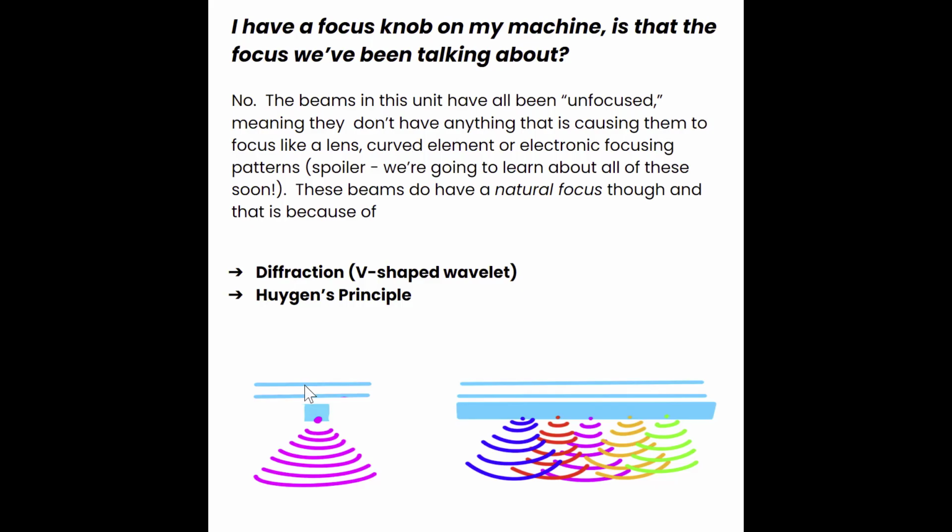So we have this example here. We can see the pressure changes are happening on the PZT crystal. This tiny little crystal is creating this V-shaped wave. So these are V-shaped waves, also known as Huygens wavelets. And this V-shape that we get out of here is the diffraction. So if we had this pressure coming through as a wide point, once it hits this very small structure, it diffracts and creates these tiny little wavelets.